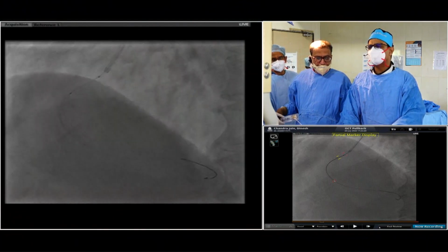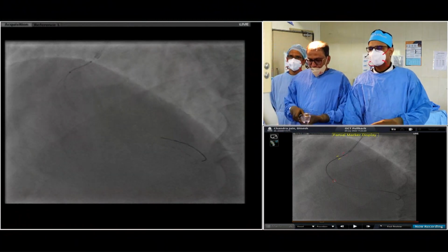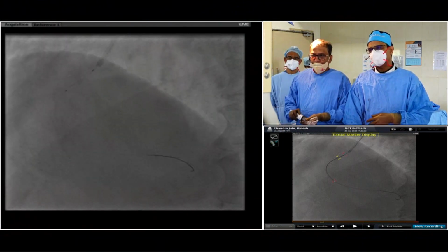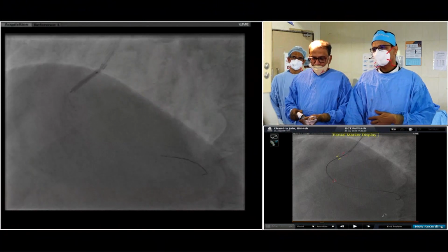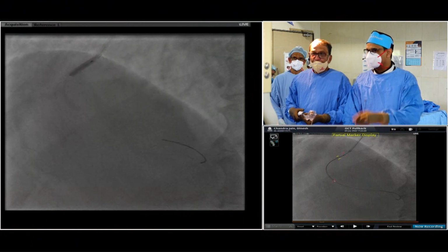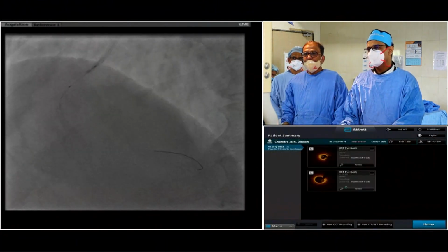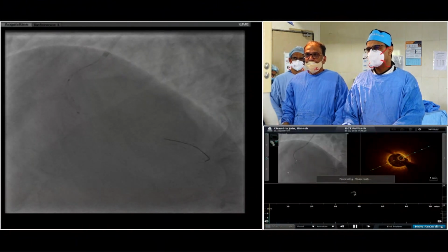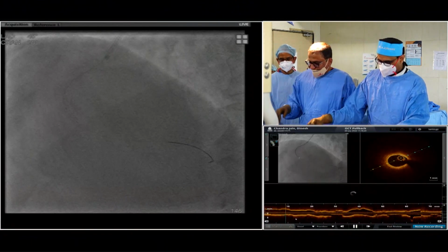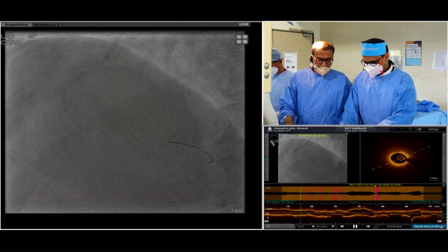Let's take a wet gauze piece and put it in his mouth. Let's dilate it here. So we are now doing what is called balloon palpation proximal with a stent balloon, right? That's right. It is more palpation than post-dilatation. Let's deflate it, sir. This is for 2 reasons. Number one, it will tell us whether we have prepared it properly. It also gives us a landmark as to where we need to land our proximal stent without using contrast.